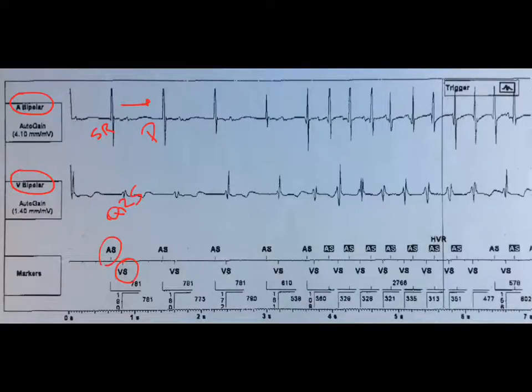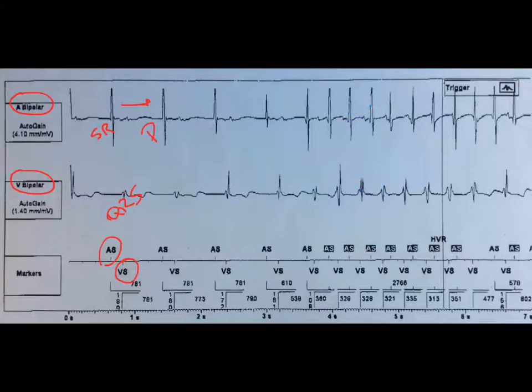The other differential diagnosis, or the other possibility, would be that this is a combination of an AT plus VT, and that they start at the same rate, then the VT slows down while the AT keeps going — but that's very unlikely. So because of all this, this is very likely to be an SVT.